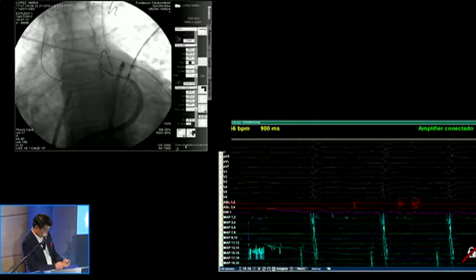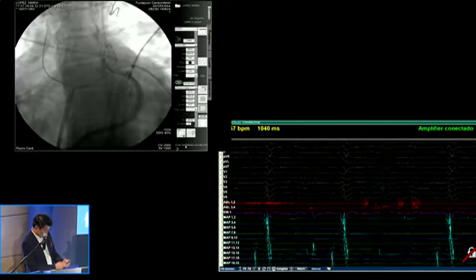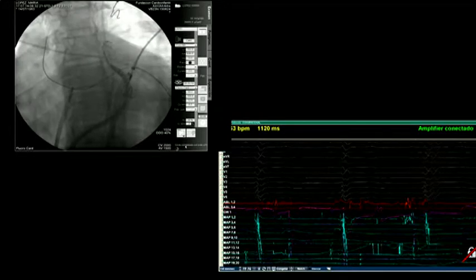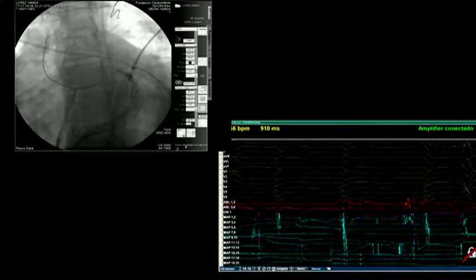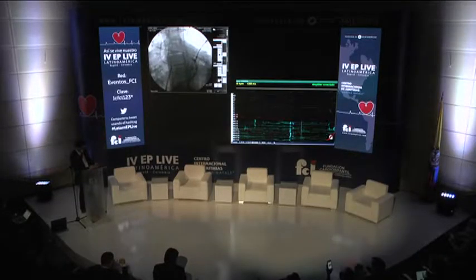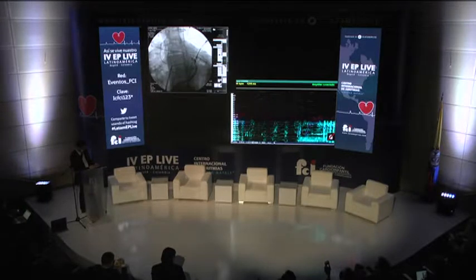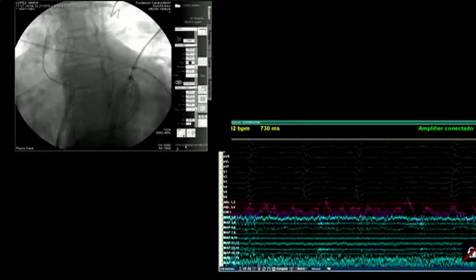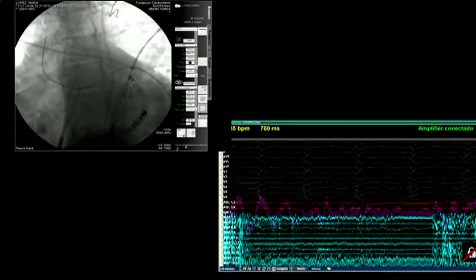and we have also been experimenting with trying to look for perforating veins and inject alcohol. Fermin found a very large perforating vein where we found a good signal from the beginning. But the problem of using alcohol in the perforating veins is that if we are going to ablate in the distal coronary sinus, we would probably be destroying the perforating veins, and it would be impossible to have alcohol as a second option. We would burn that bridge, and that's an option we have to consider.